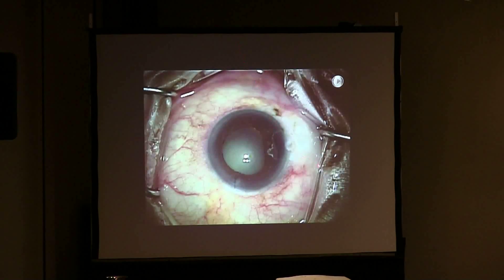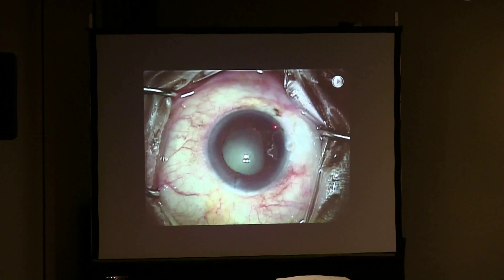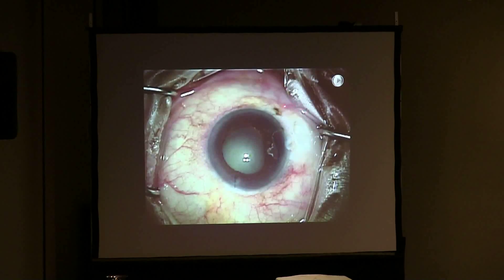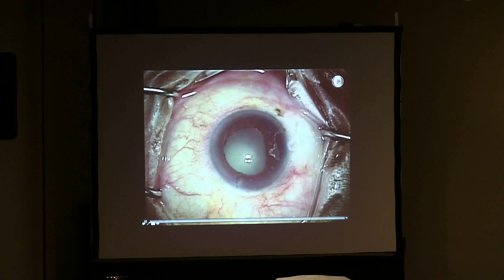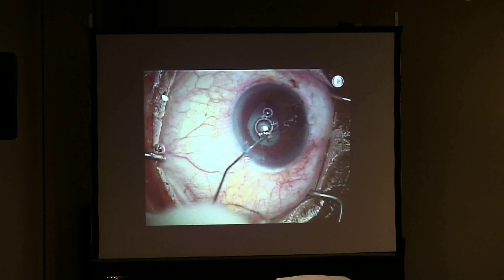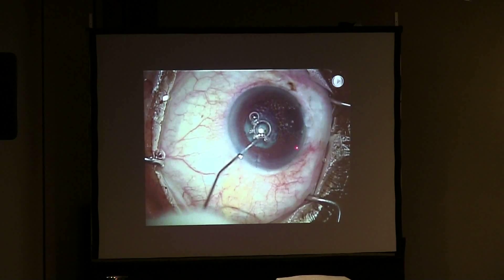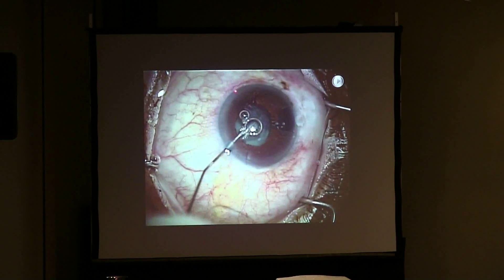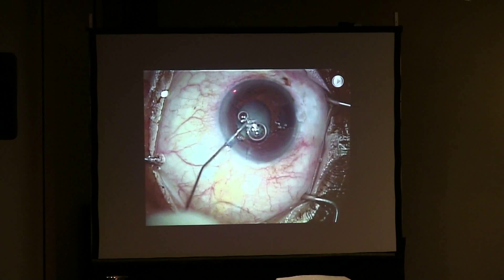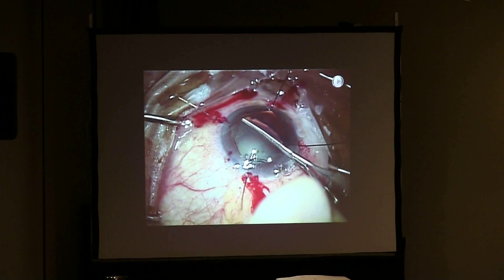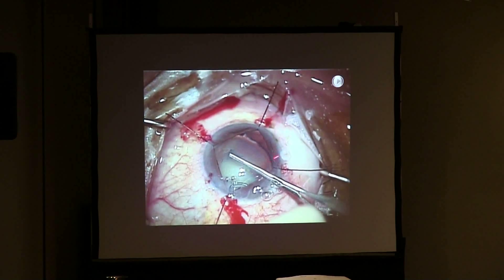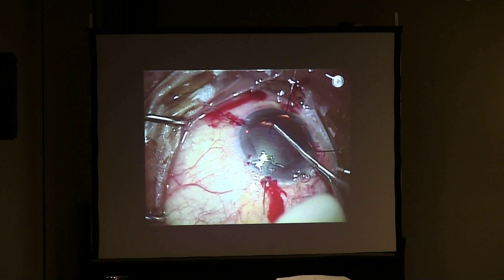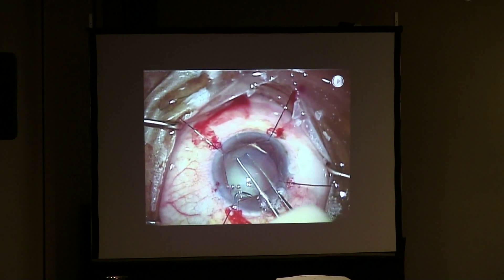This is a patient referred by my glaucoma service who had had glaucoma surgery. You can see the trabeculectomy bleb, and an over-generous peripheral iridotomy by the prior surgeon. Not only did they affect the iris, but they also damaged the zonules. This patient has essentially no zonules from 1 o'clock all the way to about 8 o'clock — more than 180 degrees of zonular absence. I start with iris retractors and proceed very gently to avoid further stress on the remaining zonules.